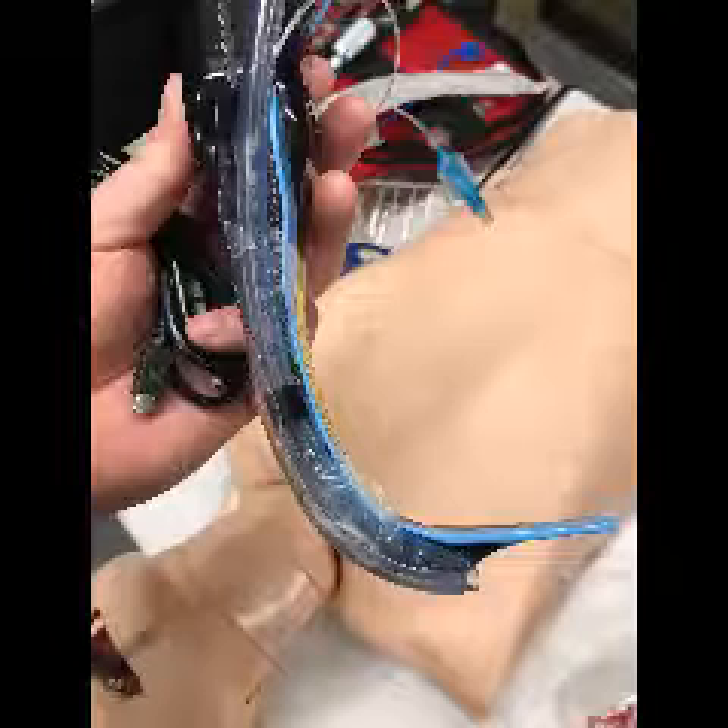It's good to see different anatomies on different airways, and I believe that's one of the really good points of the AirTrax — we have the capacity to look at recordings of just different airways. You can see that the anatomy looks different on a lot of people. It's not just looking at the mannequin like we do in class. So here are the videos, enjoy.